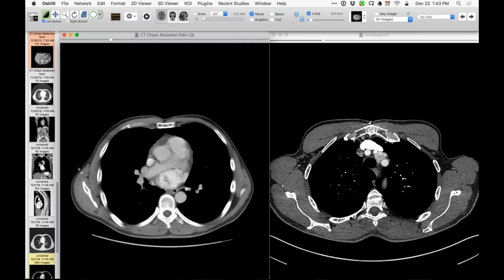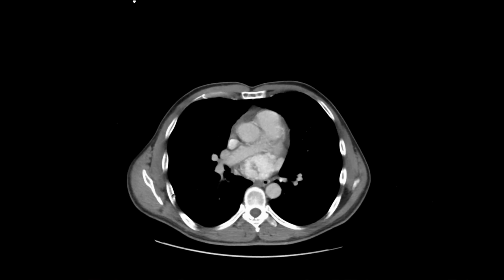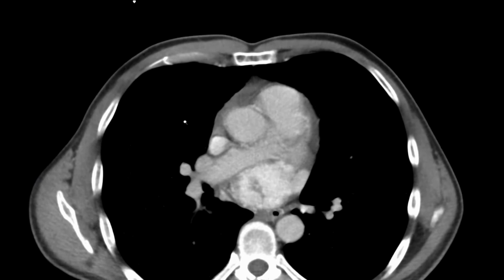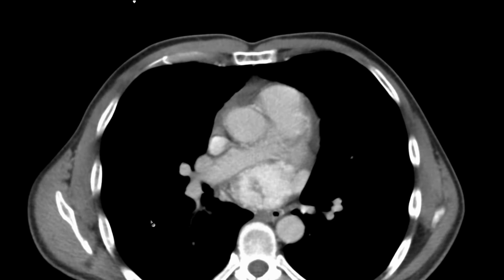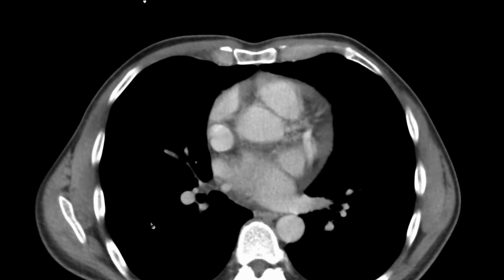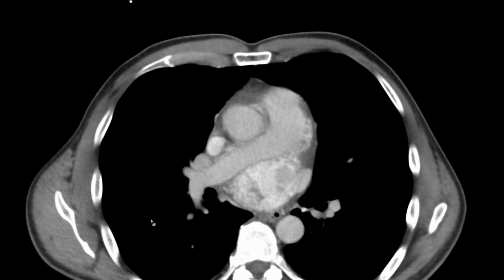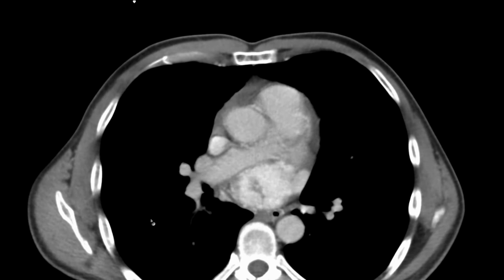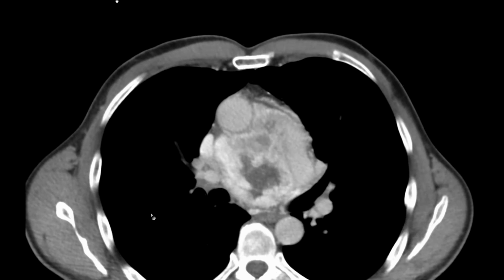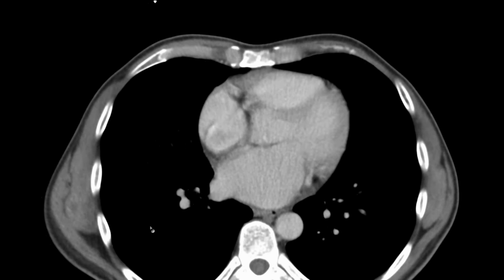I think it's going anterior to it. Right, but if you go lower, it looks like they join together. Somewhere there. Yeah, keep going down now. See, right there, it just looks like it dives into that larger pulmonary vein. Right there, it looks like they come together. And I don't know. Left atrium. Like it's opened a pathway of the... Oh, don't know. What's going on there? It is curious. I didn't notice that. If you go up higher, it looks like it goes into the tumor. I don't know, it was just weird.